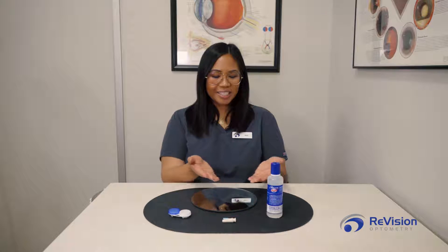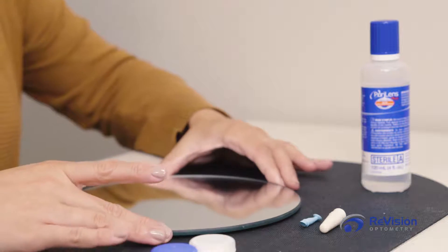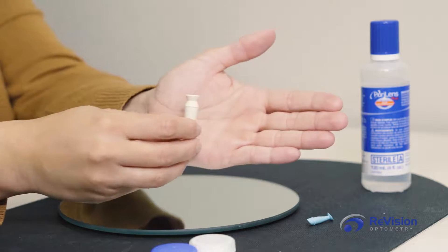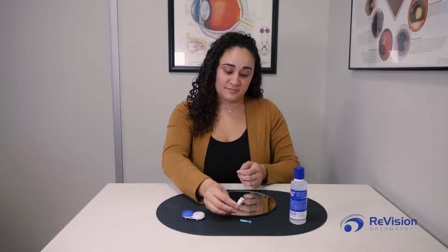Before we get started, prepare all materials needed for applying your scleral lenses. You'll need a flat mirror to place on top of a table, and a DMV — also known as a plunger — which is the device used to help assist you with applying and removing your scleral contact.